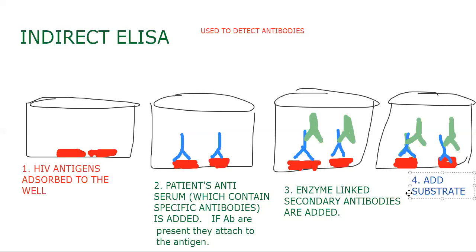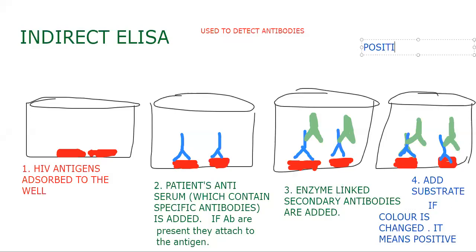If it changes the color, add substrate. If color is changed, what can you say? Color is changed, which means positive. Again, the scenario gets changed. If color is changed, it is positive. I am going to declare now that this is a positive test. Okay, so next, let's do the negative test.